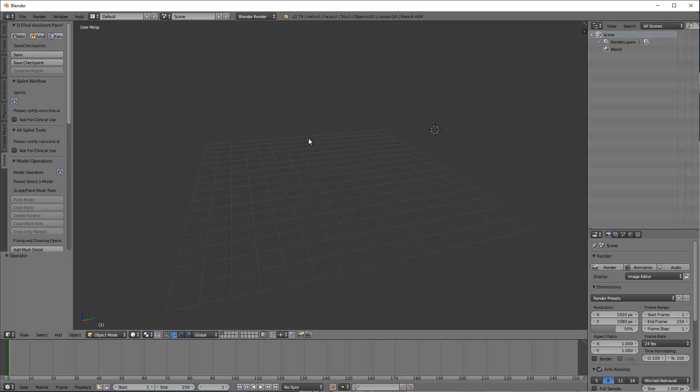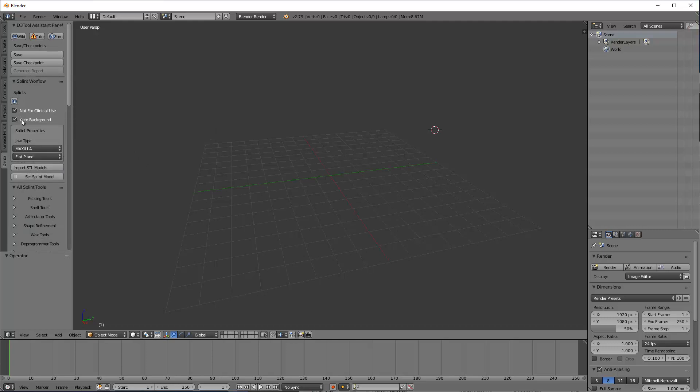So the software is now opened up, it's updated. Make sure you do that. I have videos that show you how to update it. The first thing I'm going to do is go to the splint workflow. It says not for clinical use. That's just basically you're taking responsibility for the design outcome from here, so the software developers aren't taking responsibility. If you don't like that, if that doesn't make you comfortable, then go ahead and send it to a lab.